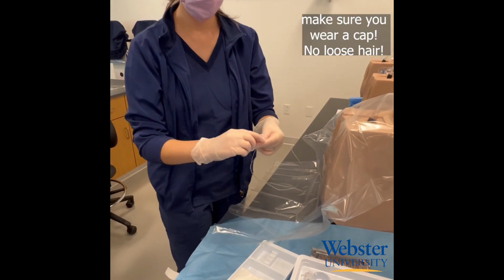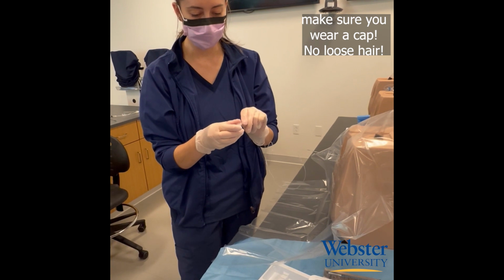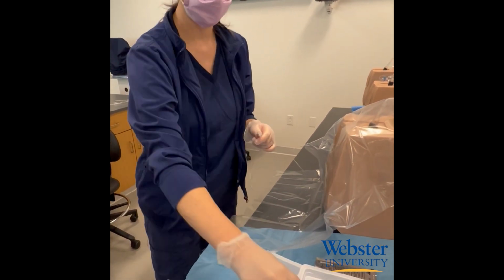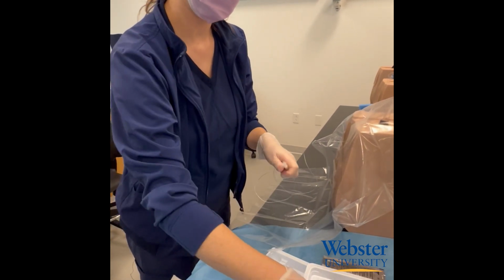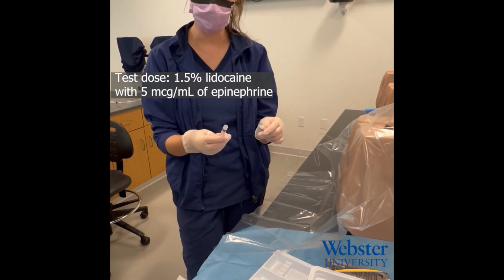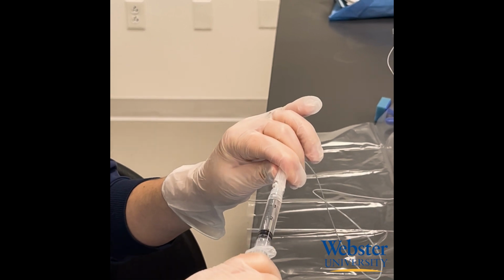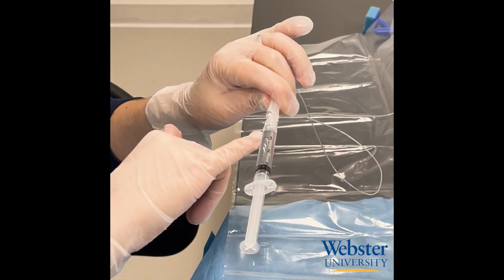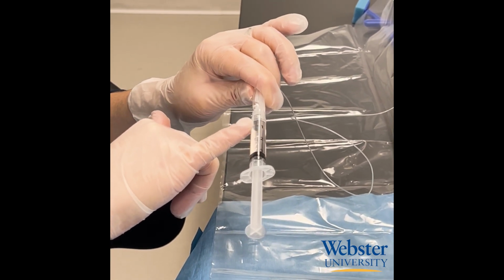Now I want to test to make sure that the catheter isn't subdural, intrathecal, or intravascular. So I'm going to attach this catheter to syringe adapter to the end of the catheter. That way I can inject the 1.5% lidocaine with 5 mcg per mL of epinephrine test dose. The first thing you want to do is aspirate. Pull back on the syringe and make sure you don't see any barbotage, which is the swirling of cerebrospinal fluid or blood.